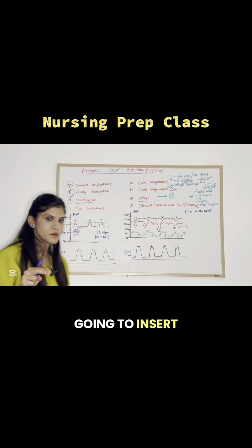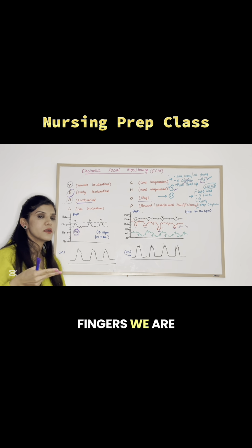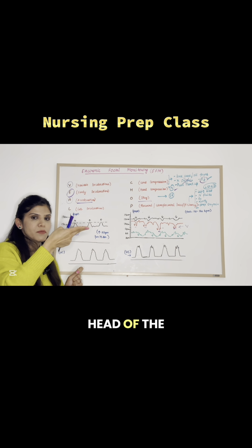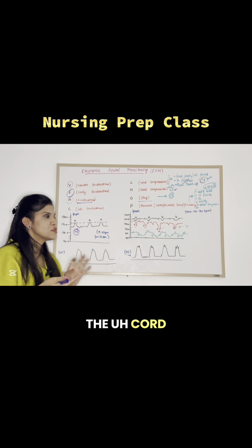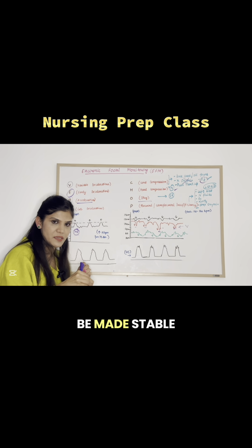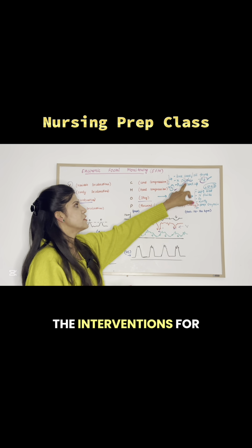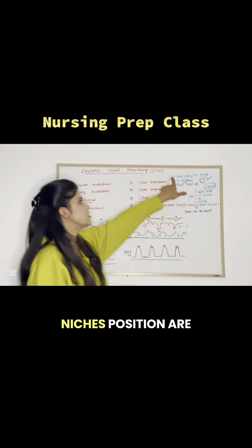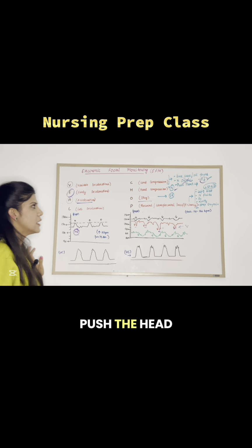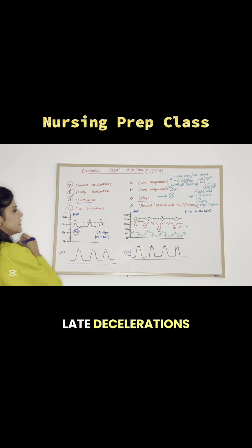So we are going to put on the gloves. So with the gloved hand, with two fingers, we are taking the fingers into the vaginal canal and lifting the head of the baby up from the cord, so that the cord's blood supply can be resumed, or the condition of the patient can be made stable, so that we can take her for cesarean section. So these are the interventions for variable decels: knee chest position or all fours, stop the oxytocin, give oxygen, and push the head up. Next coming on to L, late decelerations.